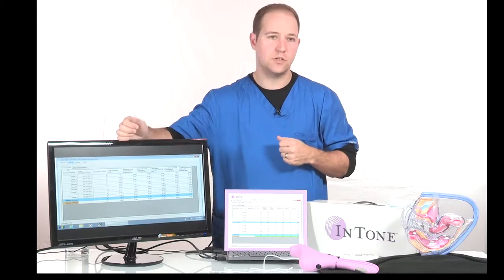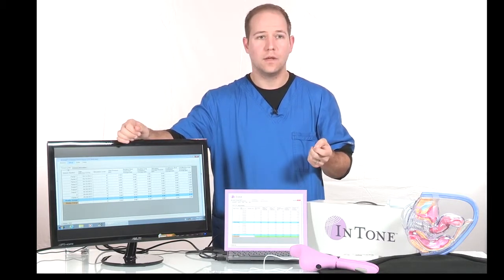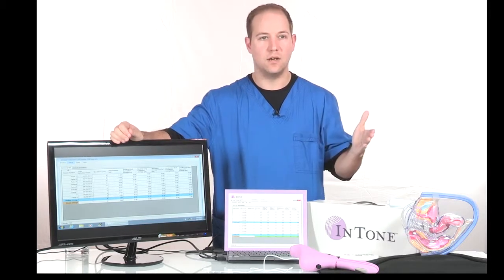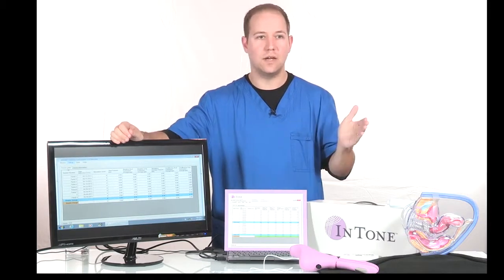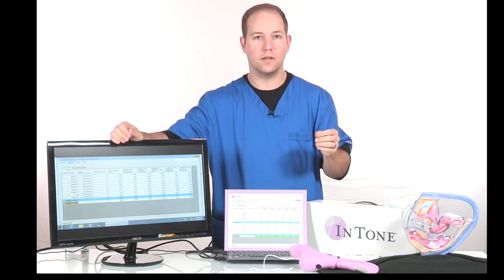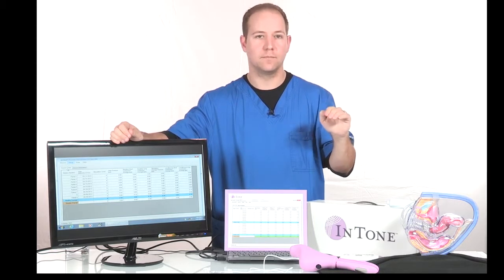If the next day she pumps it up to a 10, it will read 1.0. The variation in pumping it up from a 5 to a 10 will skew the data so that we won't see measurable progression of the pelvic floor strengthening because we have not stabilized a baseline reading.